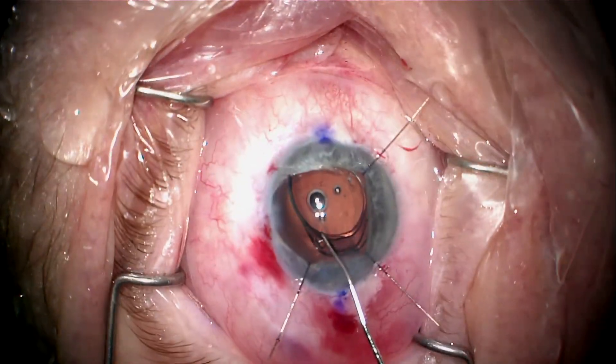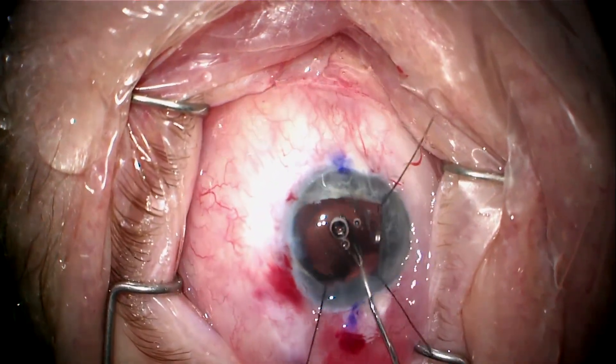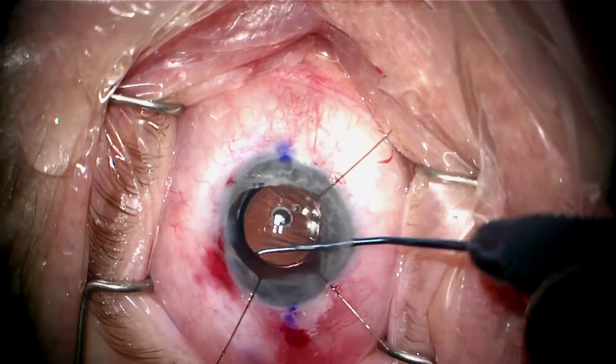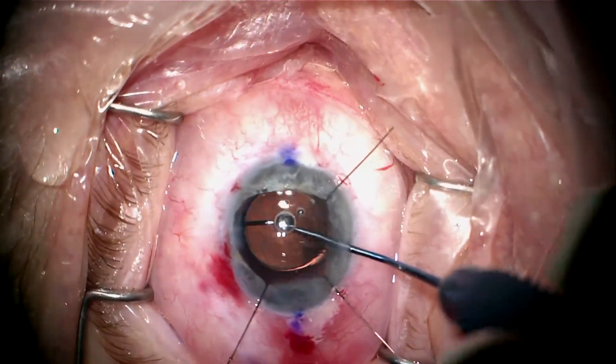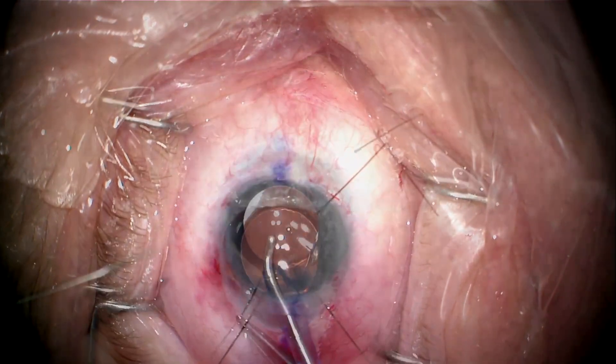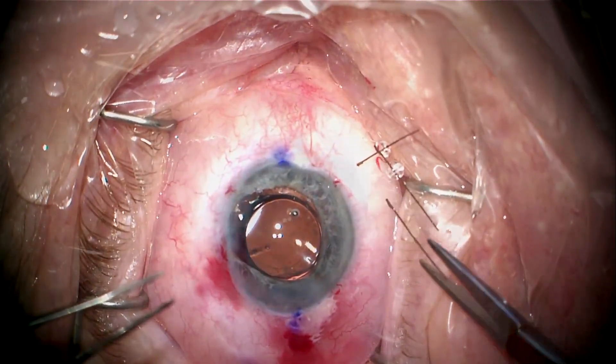Here I'm placing a toric lens on the steep axis, which is 50 degrees — you can see that's been marked. I'm sweeping lens epithelial cells so there will be less capsule contraction. And now we can go ahead and remove the viscoelastic.